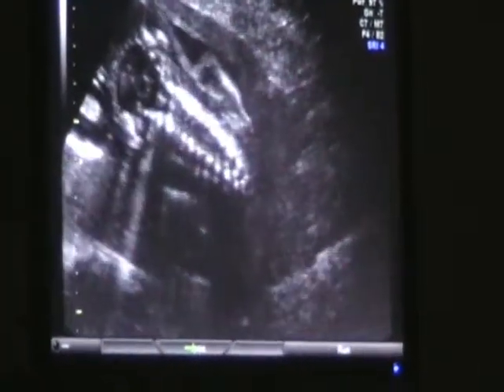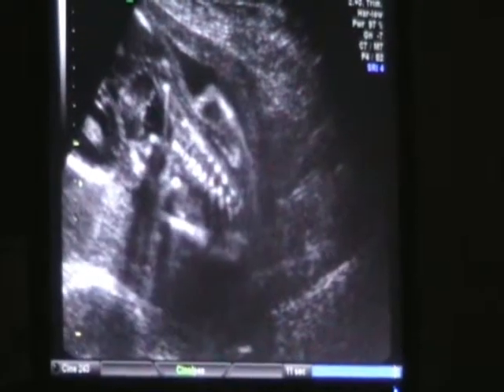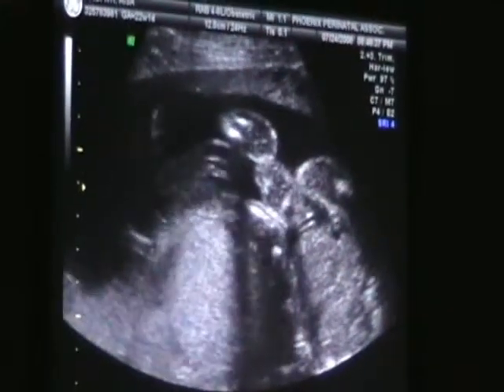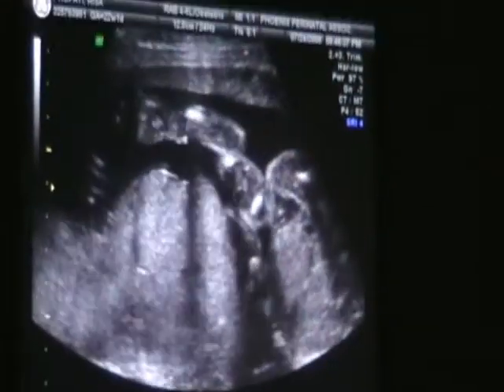Here's her back — back right there. It's really good. All right, let's have you lie flat again. Let's make a video clip. I'll catch it. It was at the very end — I'm having to do some still pictures to see. Yeah, she's showing off.